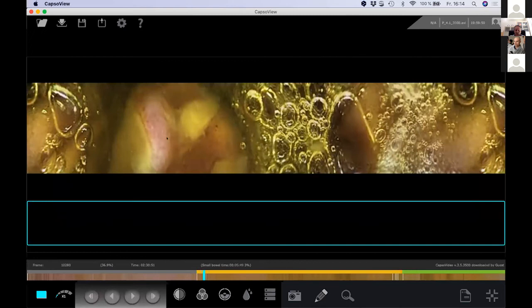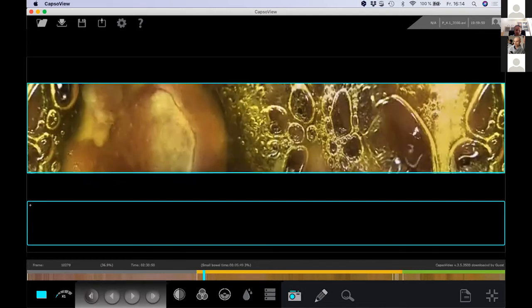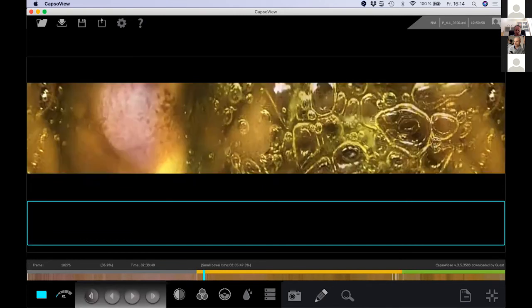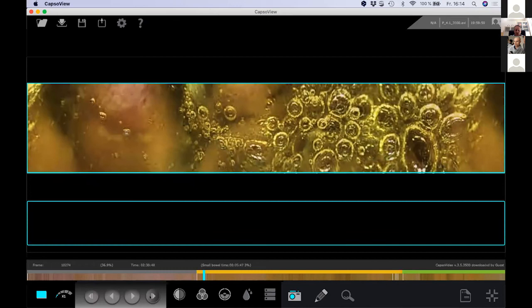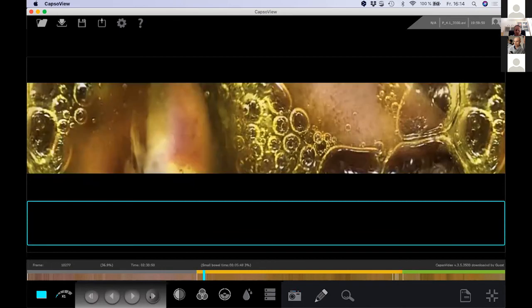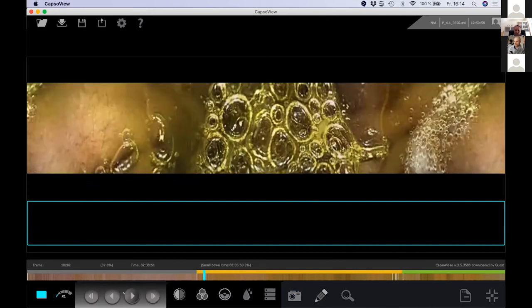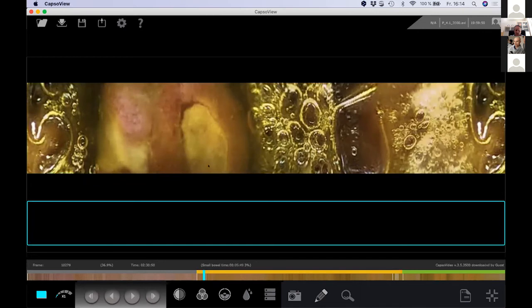This is the lesion with ulcerations on the top. I can't tell you what kind of tumor it is because it's a brand new video. We did surgery last week and I'm still waiting for the histology of this tumor, but it was a 4 centimeter large tumor in the proximal jejunum. You can see we have only a small number of pictures: 1, 2, 3, 4, 5, 6, 7, 8, and that's it. 8 pictures, not really impressive, but this is a big tumor in the small bowel.